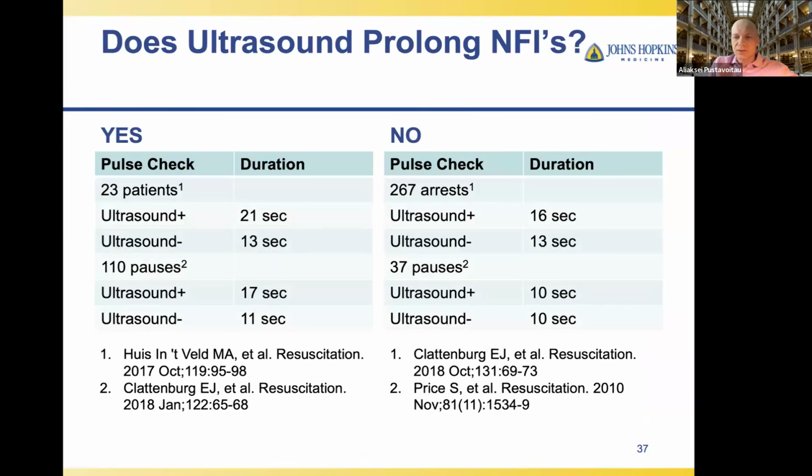So these are the several studies that were done on this subject. If you look for pulse check, with or without ultrasound, and you see what those durations of pauses are, you see some studies that say it's substantially longer when ultrasound is used. It's in the columns that say yes.